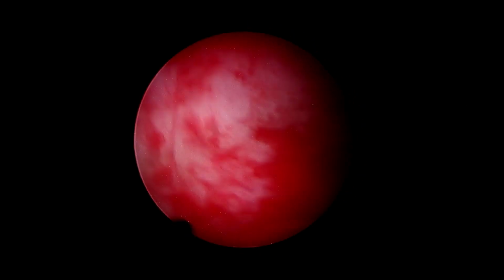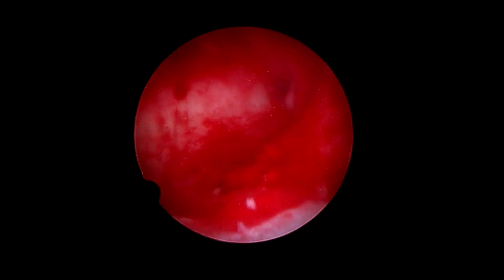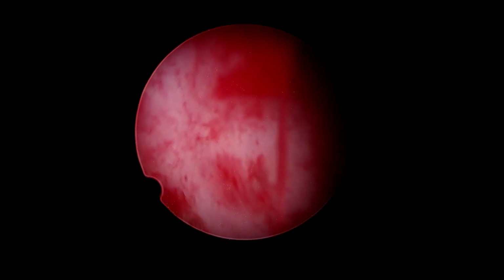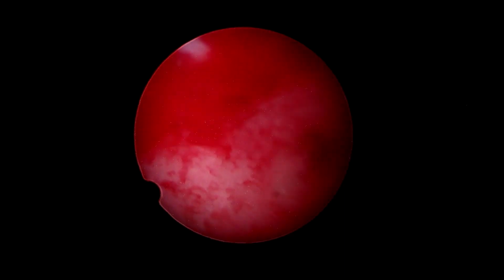So that's it. We have achieved a good amount of endometrium and endometrial cavity. You can notice the endometrium present inside the uterus is more than 60%. So we definitely hope this patient becomes pregnant in the coming days.